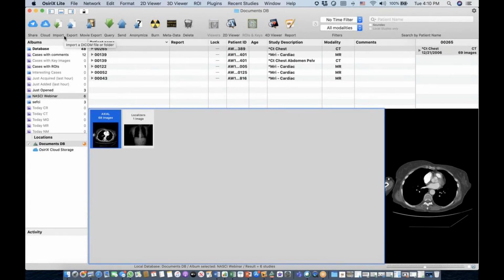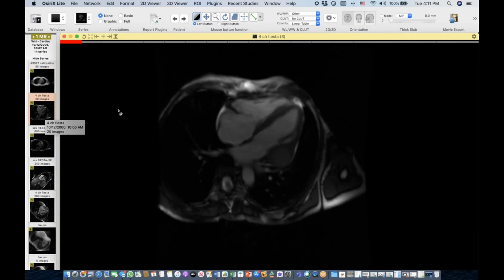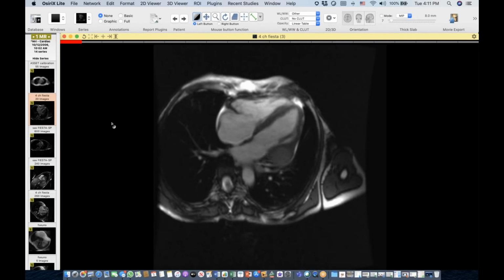I totally agree with Joan's comments, and I think in our practice we're seeing more often that the oncologists are more and more aware of the potential role of CT here. So instead of getting an echo or an MRI to look at the heart and then a CT to look at everything else, the chest, abdomen, and pelvis, we're doing more and more combined cardiac CT that covers the chest plus ungated AP for patients who have either had a known or suspected cardiac met, who had an equivocal echo finding, who have a thrombus at the tip of a central venous catheter, or something along those lines. If they're going to have to get a CT anyway, just do the cardiac CT as part of the comprehensive workup.